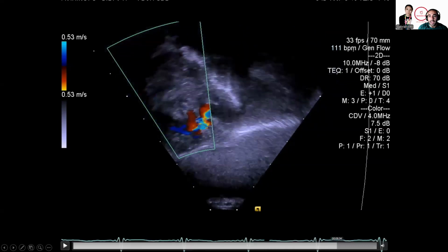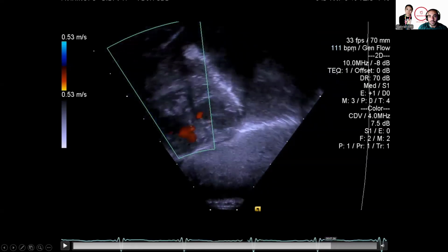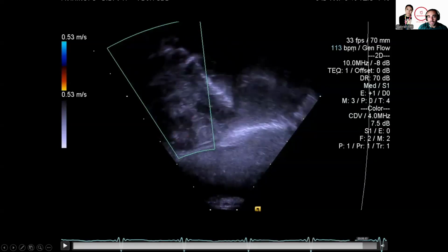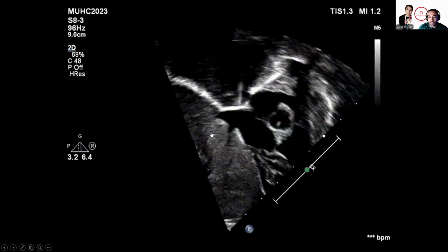And then here, I actually scan the septum, and you can see that if you're more from the cardiology perspective, you don't go throughout the septum, you would miss, towards the end as you go very anteriorly, this communication, which is actually a ventricular septal defect, very anterior and closer to the apex, and it's here. It looks very small and it's muscular.